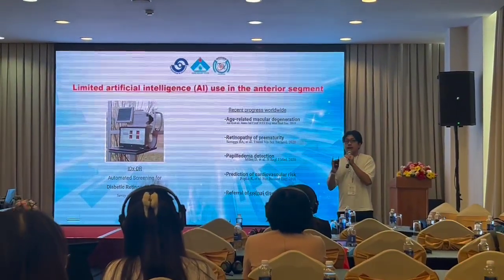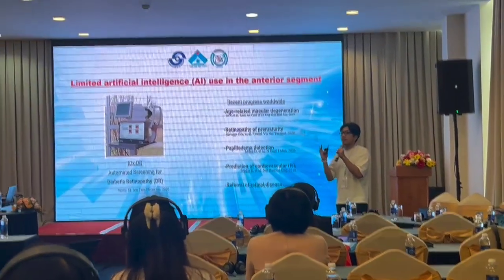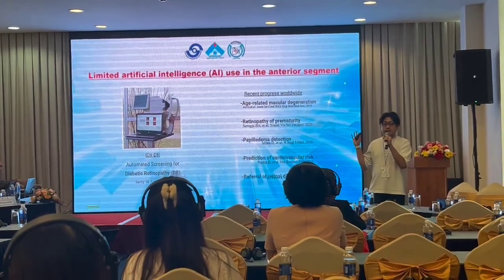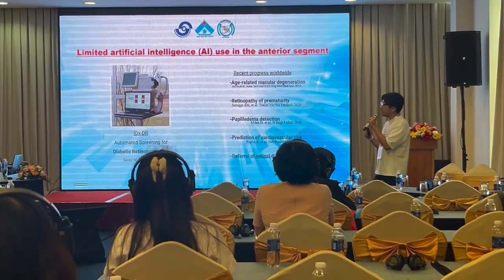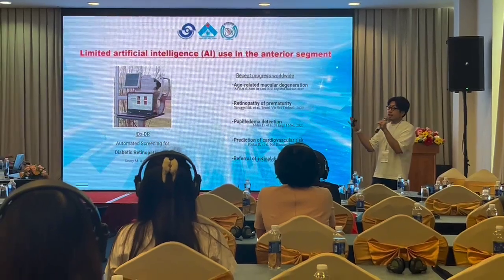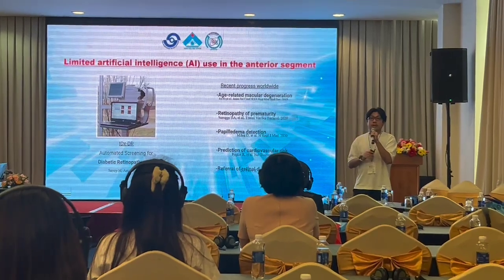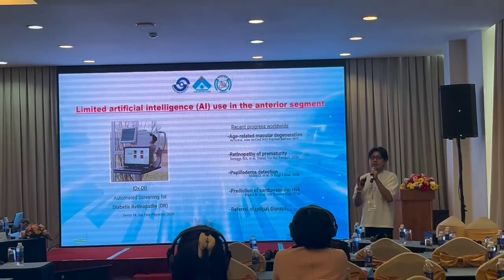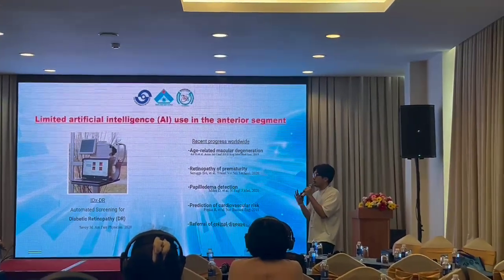Okay, so for the background, as we all know, the value of AI is increasing in ophthalmology as well, starting from retinal imaging, OCTs, fundus photos, and so on. There is one article which estimates papilledema from the fundus photo, and that was published in the New England Journal of Medicine, one of the most valuable journals. So AI in ophthalmology, we know, has a high value, not just in ophthalmology, but also in the whole practice.